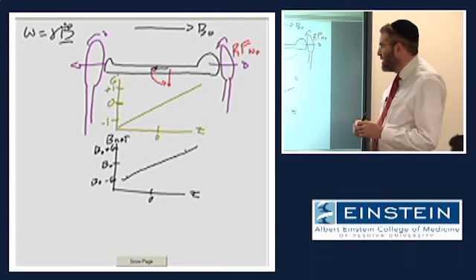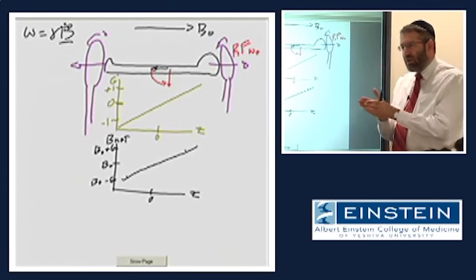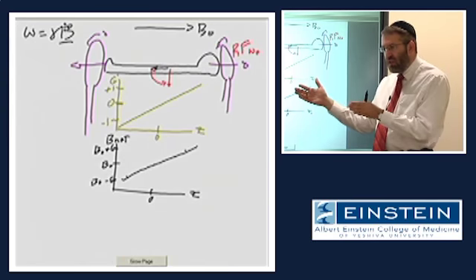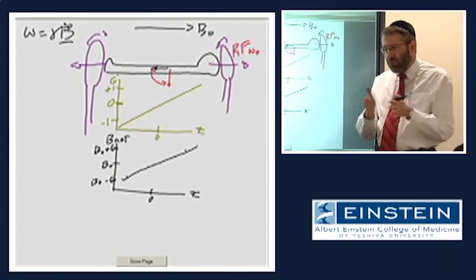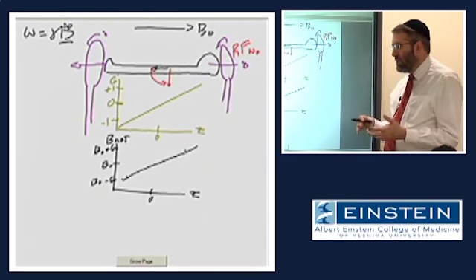And also, in real life, the way the vendors generally set things up, they talk about distance inside the bore of the magnet as being plus or minus relative to the isocenter of the scanner. Okay? But in a sense, it's arbitrary.